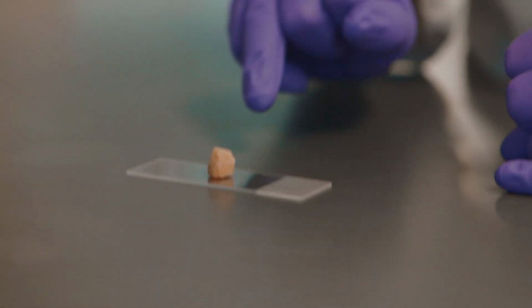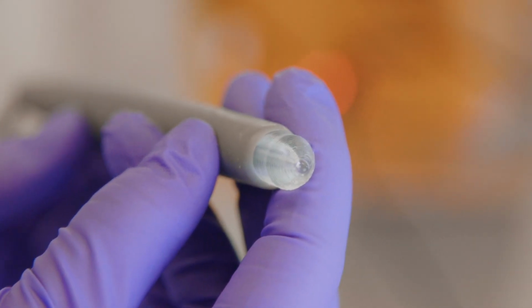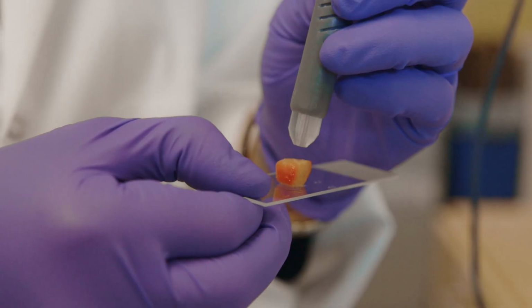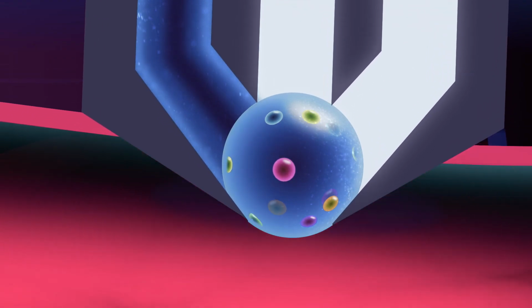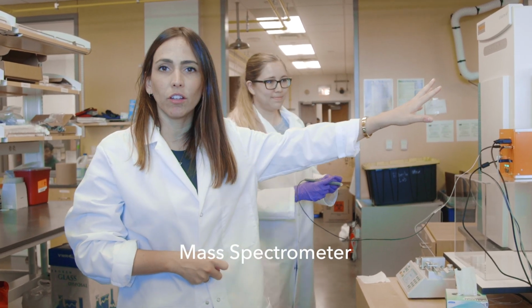This is a piece of human tissue. This is ovarian cancer. The way that it works is the MasSpec Pen at the tip has a tiny reservoir where through tubing systems we fill that reservoir with a single water droplet. And then once it is touched on the tissue, it interacts with the tissue to extract molecules that are soluble in water. So this is the mass spectrometer that we currently use.